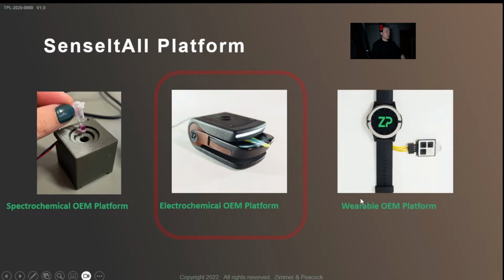The two things I will talk about today really are what I call our electrochemical platform, though we do have a spectrochemical platform as well, and our wearables platform, which is also electrochemical. The one in the middle talks about what I call point of need testing. Sometimes it's called point of care diagnostics if it's specifically in the medical field, and sometimes people call it spot testing: I have a sample, I put it on the sensor, I get a result. The one to the right, the watch format, is more for wearables.